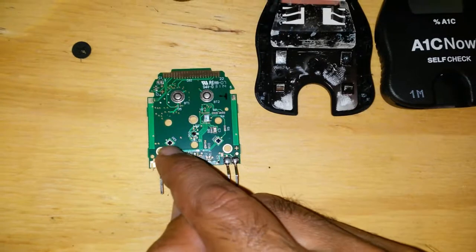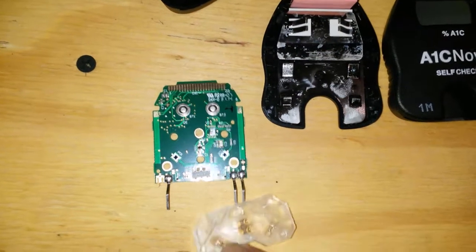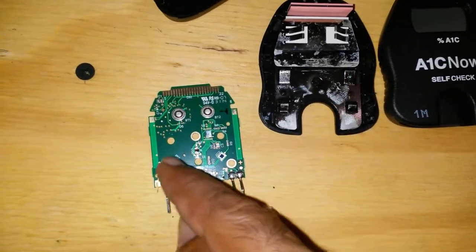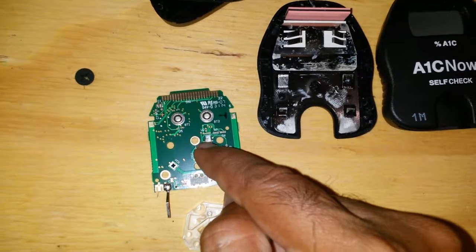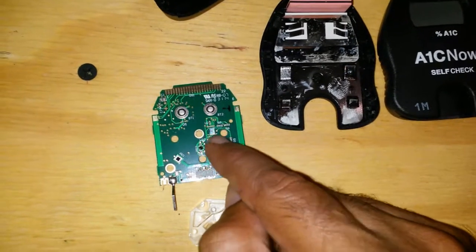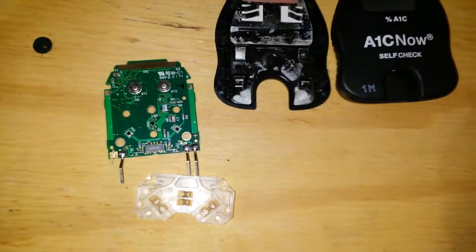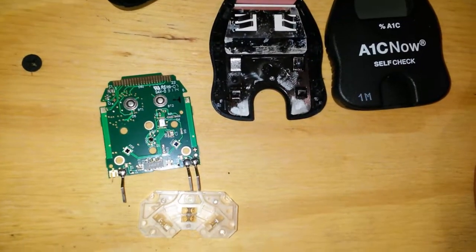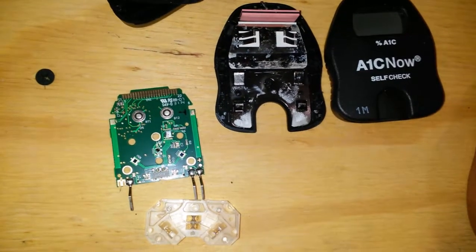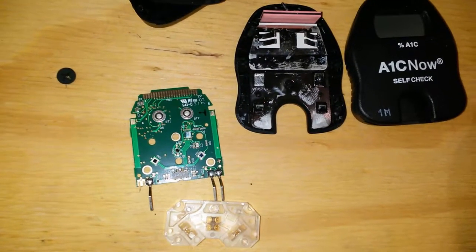There are three chips, right? And there's the next one there. So there's four things going on here, and that corresponds to these. If we look, 1 2 3, 1 2 3, and that's the actual processor that comes off from there, and it comes off these, if you notice the traces. But oddly enough, that is not actually well potted. If you rub something against it, you damage your traces. And it had some dust when I was trying to take the microscope pictures many months ago, and I damaged the traces in that one. So what I'm going to do is pop this one open and see if I can get some better pictures of that.